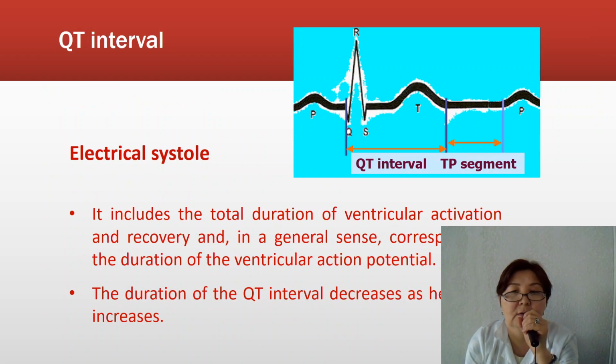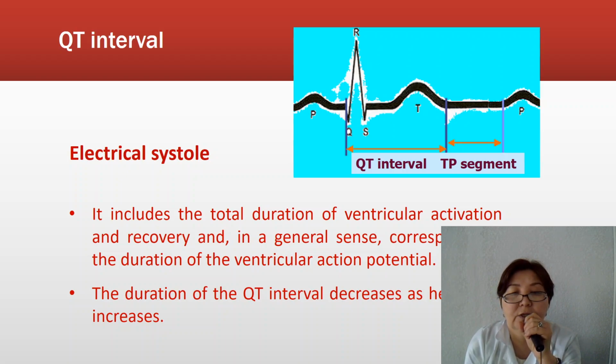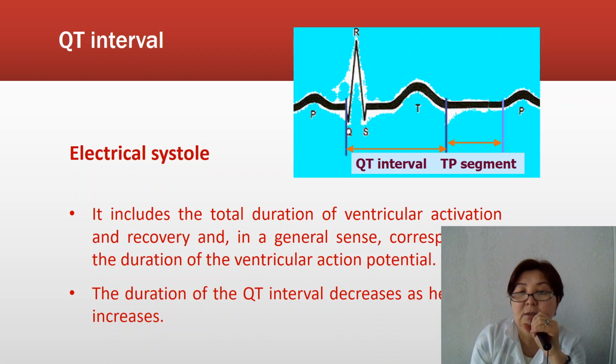QT interval. It's equal to electrical systole. It includes the total duration of ventricular activation and recovery, and in a general sense corresponds to the duration of the ventricular action potential. The duration of the QT interval decreases as heart rate increases.